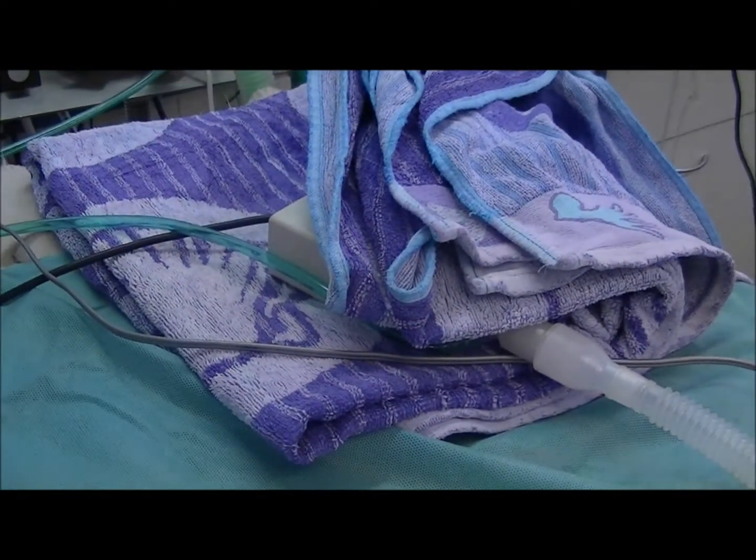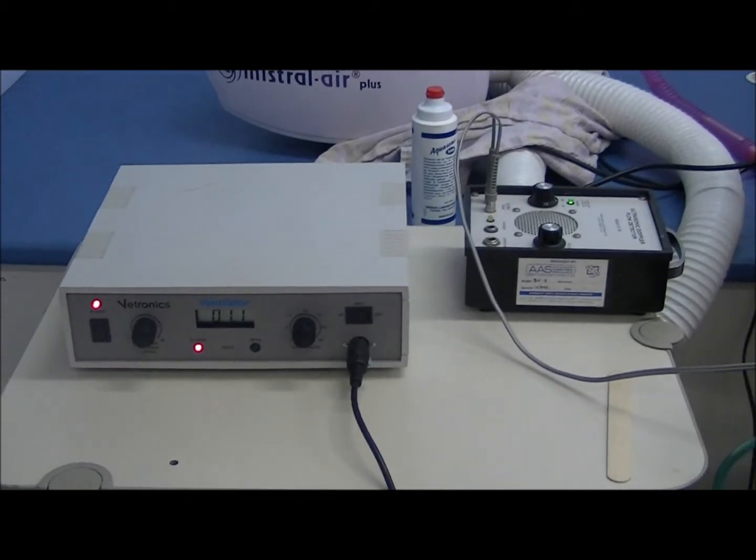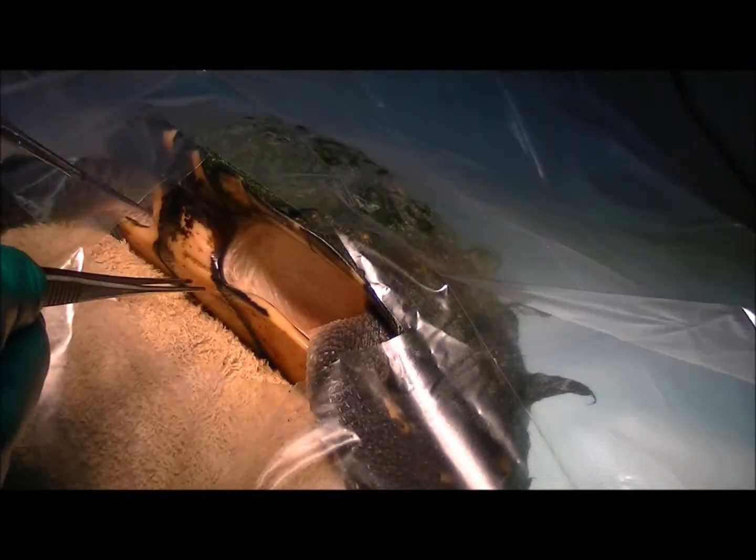We've got it hooked up to the ventilator, which is clicking away under there, and that swishing noise is the heartbeat. We have this turtle anaesthetised, she's all draped up, we've prepped up down in here, so we're going to make an incision in the skin down into the body cavity and see if we can find this fish hook.